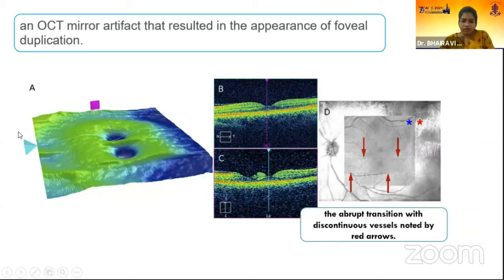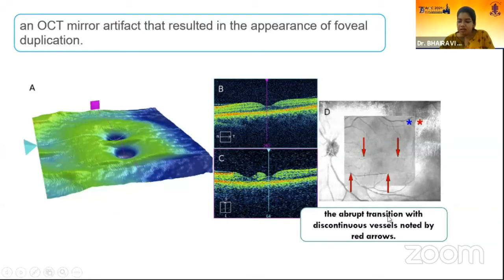Due to the mirror artifact, there is duplication of the fovea. On the en face image, there is an abrupt transition and discontinuation of the vessels, noted by the red arrows.